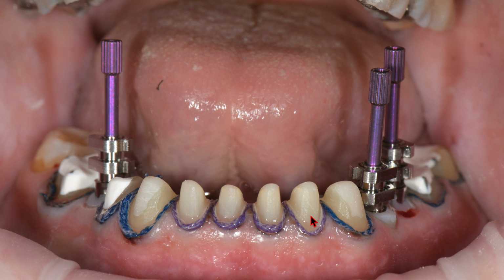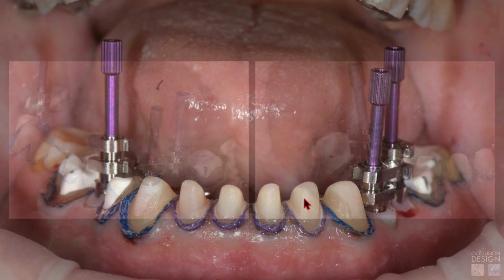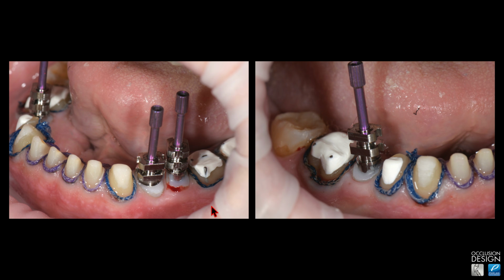And you can see all the buildups. In the posterior, I used white opaque core paste. In the anterior, I used tooth colored core paste. And I did do cores on all 6 anteriors. You can see how the custom impression transfers are maintaining the contours that the custom healing abutments had.